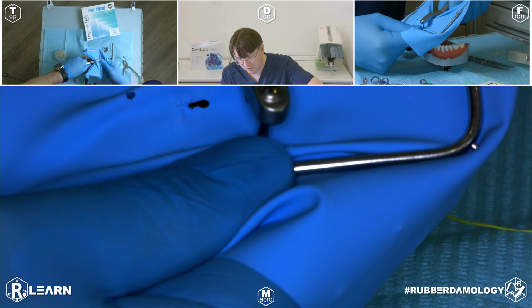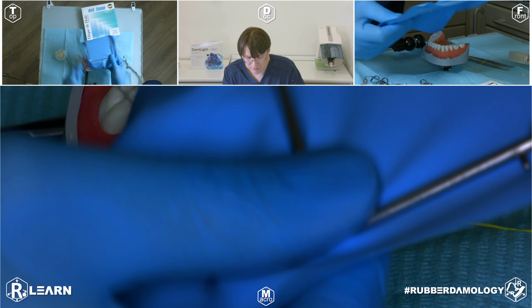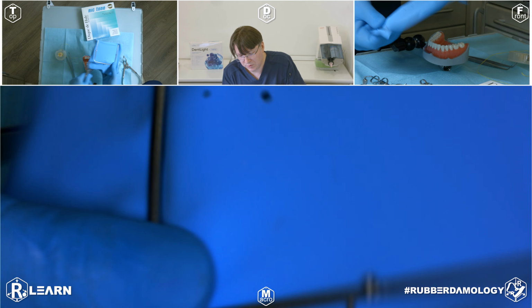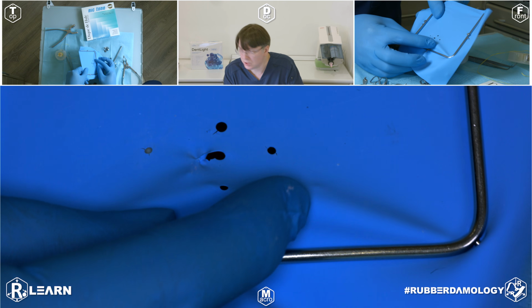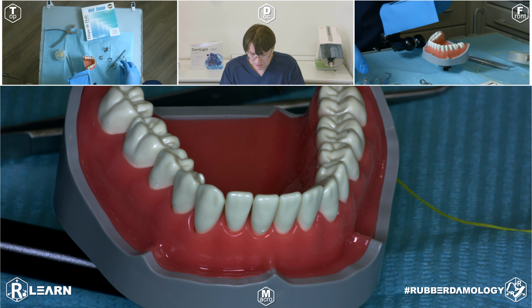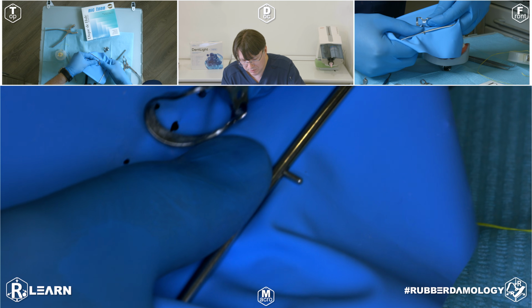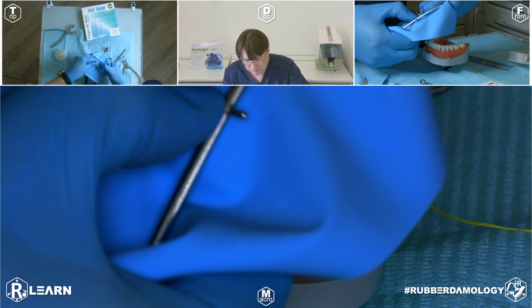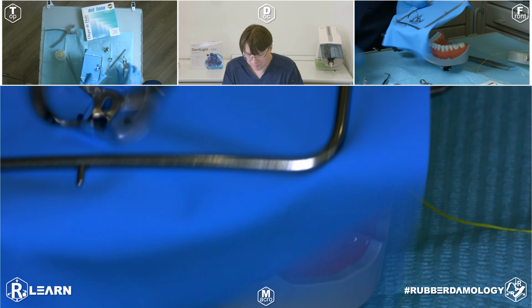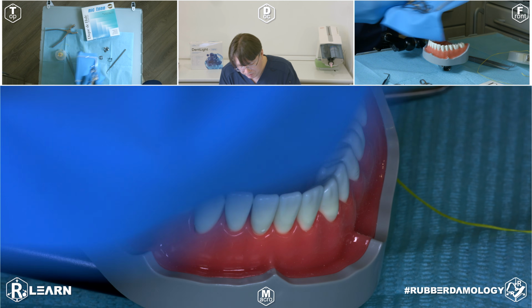41, 31, and perforation 3, 42. 3 perforations in one line for 3 teeth. Make the same fixation of clamp number 9 in the central perforation very carefully. It's ready. Also, repeat fixation of the clamp for tooth number 41.